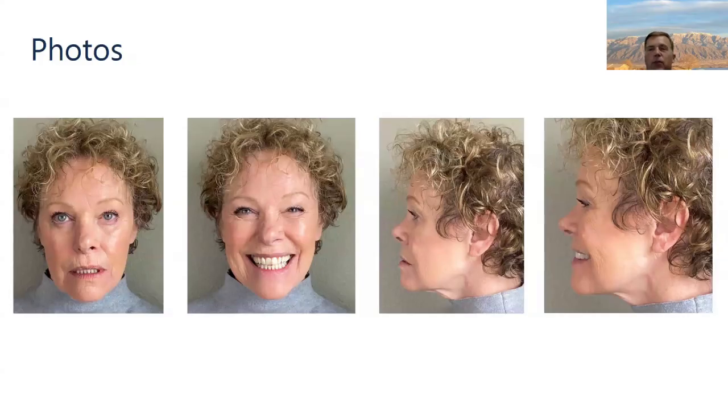For a mandibular case, if you ask the patient to say "shh," that can be a good way to see the mandibular transition line. If you have your patient say "Emma" and then take a photo right after, that will relax that upper lip and let you see how much incisal edge display you have right now. And then with the labial angle at about 15 degrees, you want to take a profile picture with the relaxed lip and the bite closed, and also a profile picture with the patient smiling both closed and open. That'll give us a nice range of photos to be able to evaluate the patient.